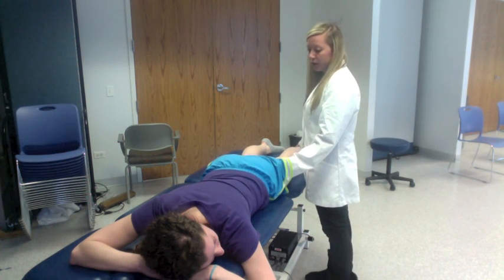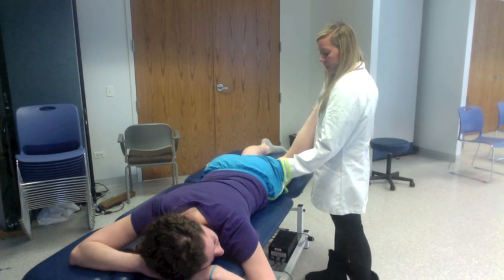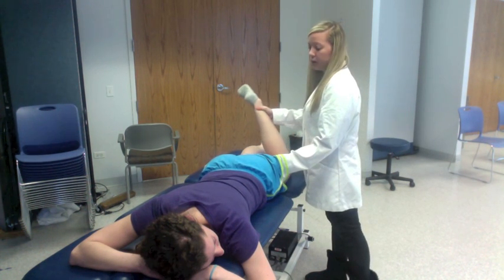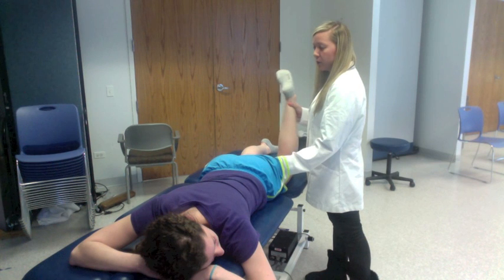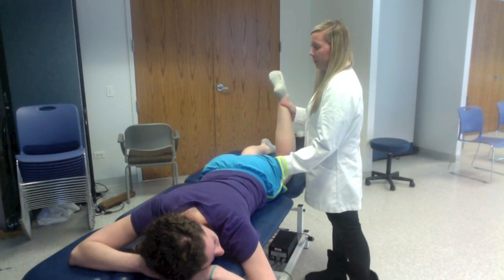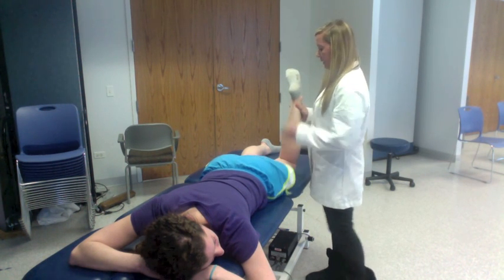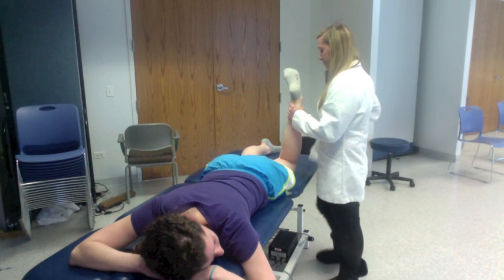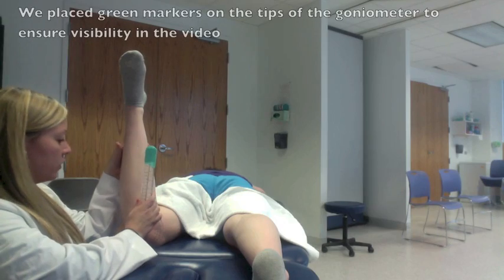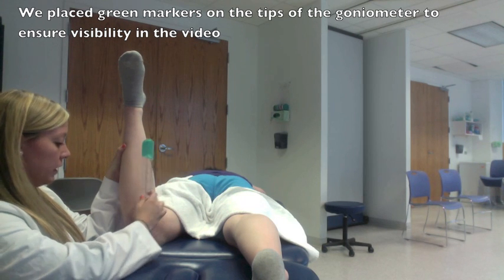I'm going to go ahead and bend your leg. And I'm going to turn your leg inwards and outwards again. What I'm feeling for is where I can feel this bone pop out the most, and that's going to tell me a little bit about the alignment of your hip. Right about here is where I feel it popping out the most, so I'm going to go ahead and take a measurement. Right here is the angle where I felt your greater trochanter most prominent.